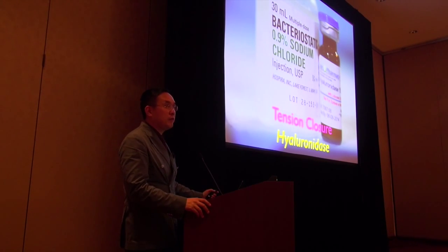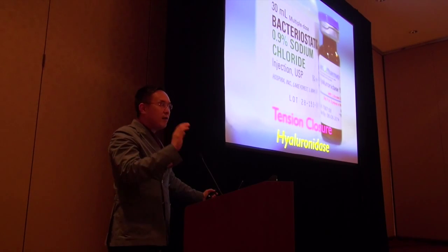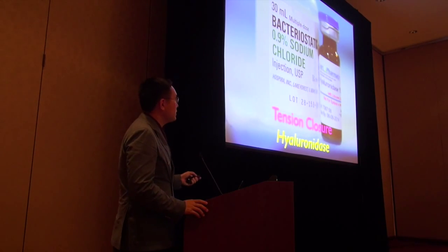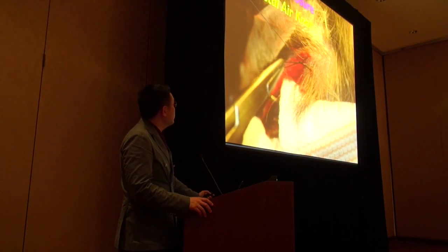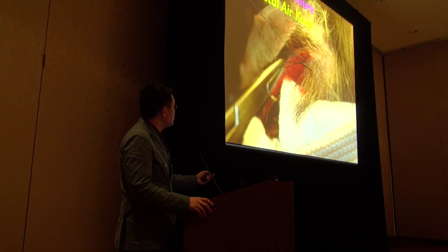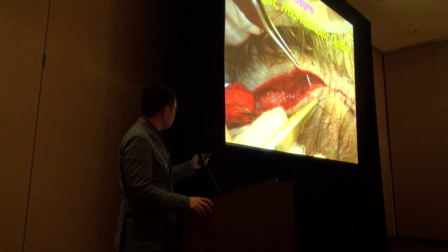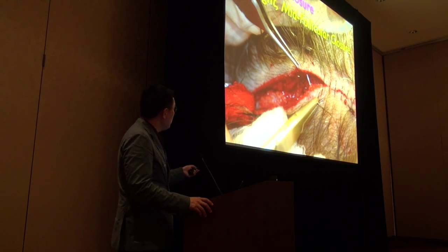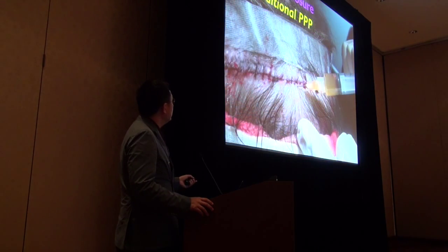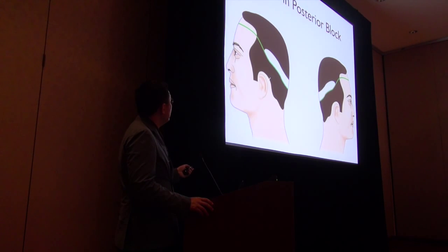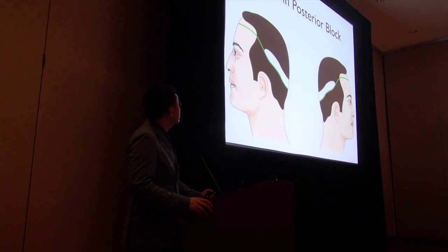This is not something you want to need. You always want to feel like you could have taken half a centimeter more — go so that you have plenty of free tension at the end. But if you're in an exit strategy, hyaluronidase can help with tight wound closures. I use a little air knot distal to the wound so it can be alleviated of pressure and the patient doesn't feel the knot. A little trick: go 45 degrees across the wound so the superficial edge pulls down vertically and you get a better overlay of the trichophytic wound edge. Then I put additional PPP at the end and a Marcaine block — a total of 20 cc's all in the back — so they feel really numb and the patient has minimal discomfort afterwards.